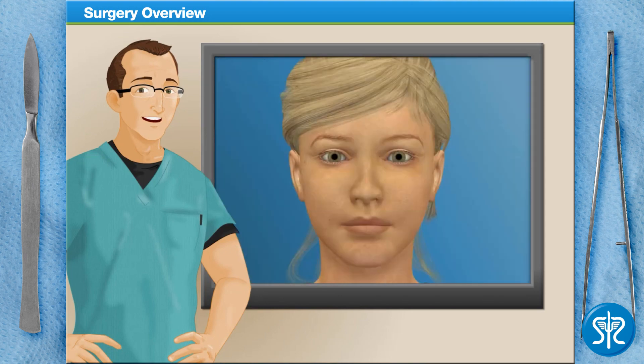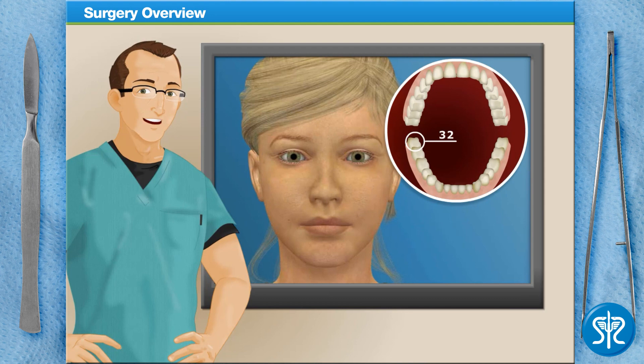Our patient today is having their lower right wisdom tooth removed, or, as a dental professional may refer to it, tooth number 32.